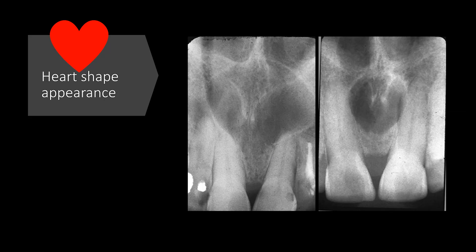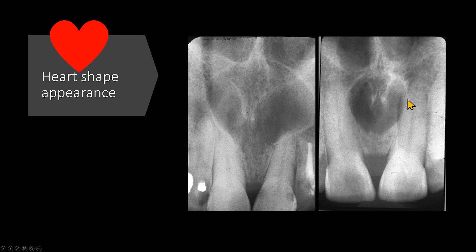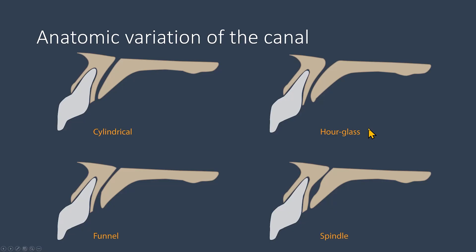These two radiographs show large nasopalatine duct cysts. This is the outline of the cyst — the outline is circular or oval. The superimposition of the anterior nasal spine gives this cyst a shape of a heart. I do not recommend you send a periapical radiograph as a greeting card to your loved ones — or maybe you should! Because these cysts are large, please note how the roots are separating more on this radiograph. On a CBCT scan in sagittal view, these are the different variations of the normal nasopalatine canal: cylindrical (uniform width), hourglass (wider at superior and inferior), funnel-shaped (wider at inferior, narrow at top), and spindle-shaped (wider at the central part). This spindle shape is a difficult appearance — it may mean an early stage of cyst formation or can be a variation of normal.